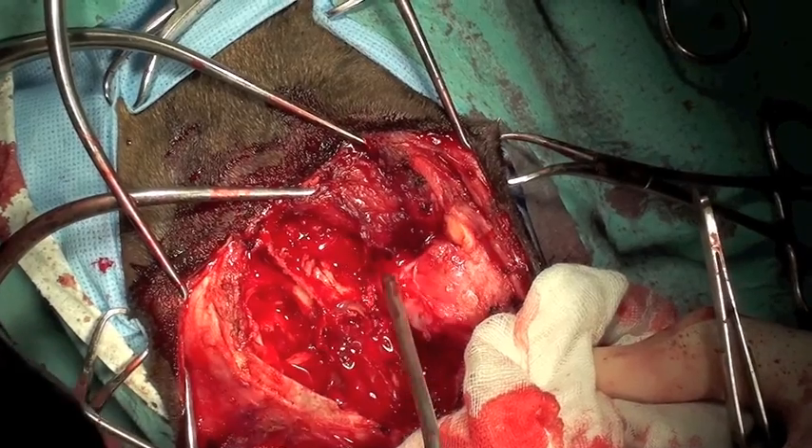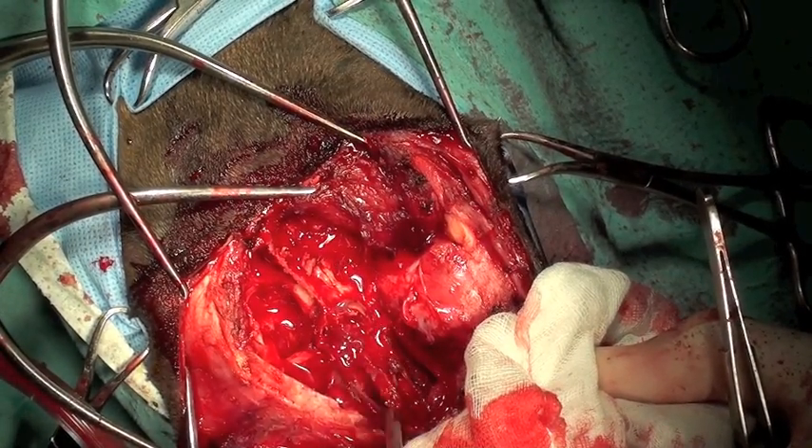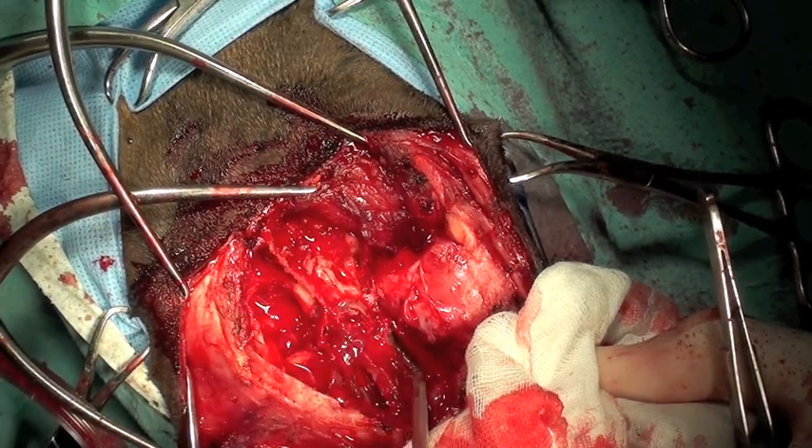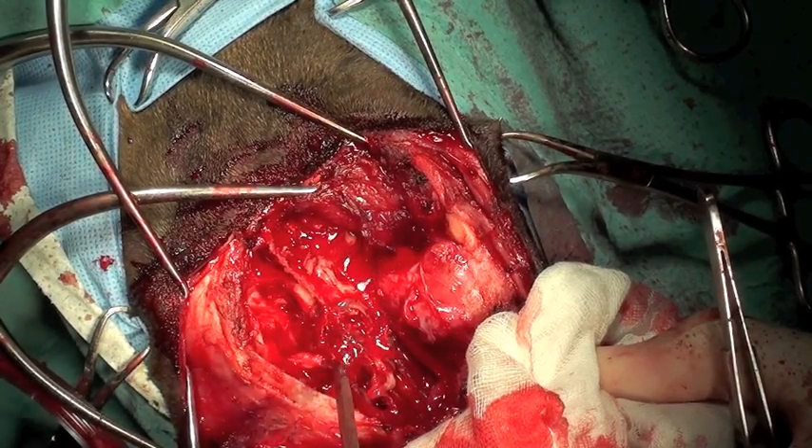At this point there was a moderate amount of blood loss, and you can see the exposed areas of brain which can be seen after removal of the tumour bone.